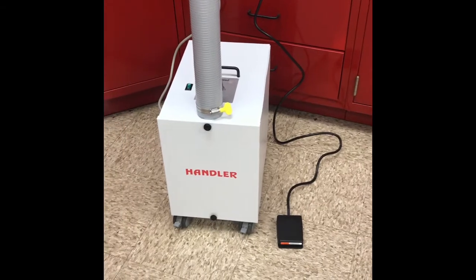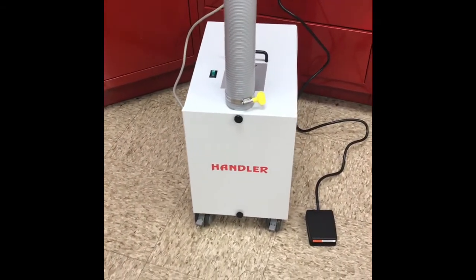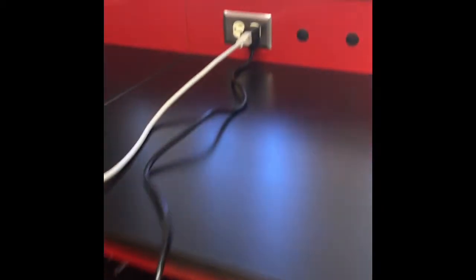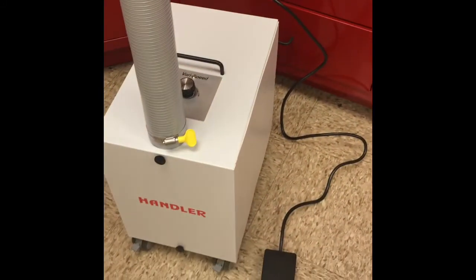Setup of the 42 ESU is quite simple. You take the gray power cord from the suction unit, plug it into the black power cord of the foot switch and plug it into a wall, and your power is now set up.